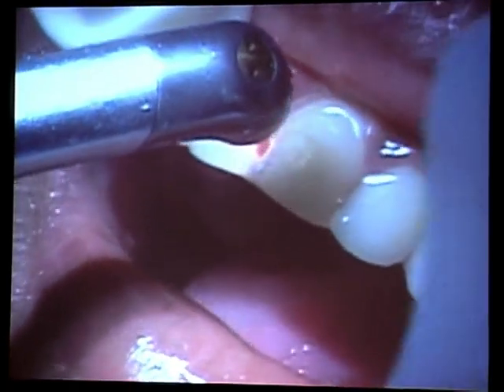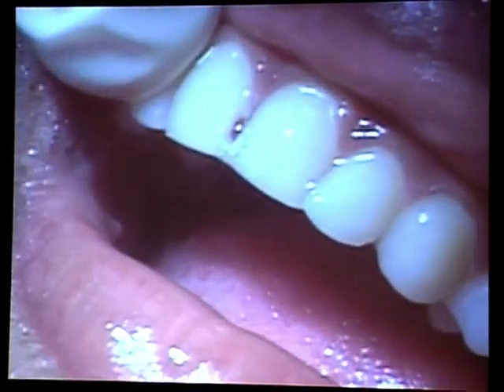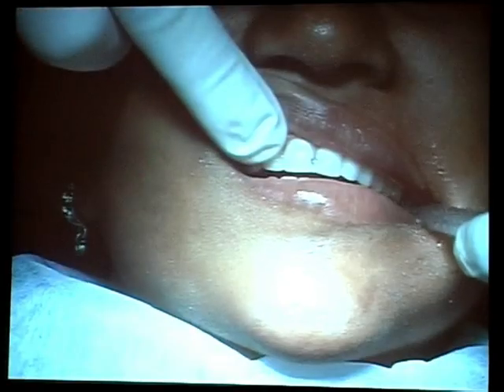I mean, theoretically it's possible to do a crown prep which is pitted in appearance, but it will take just too long at the present time. But in the near future, we are going to have very high-powered lasers. Sorry, Ralph.